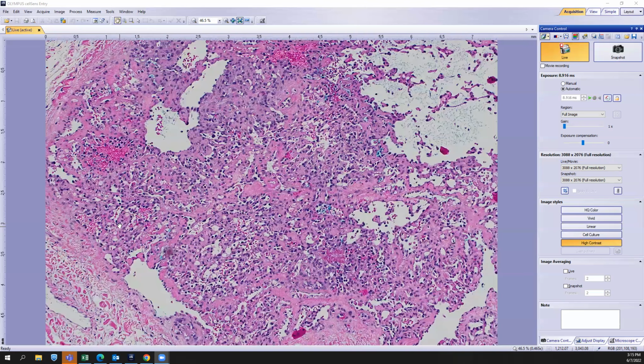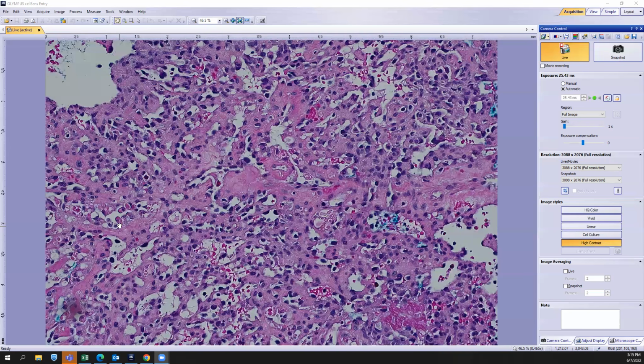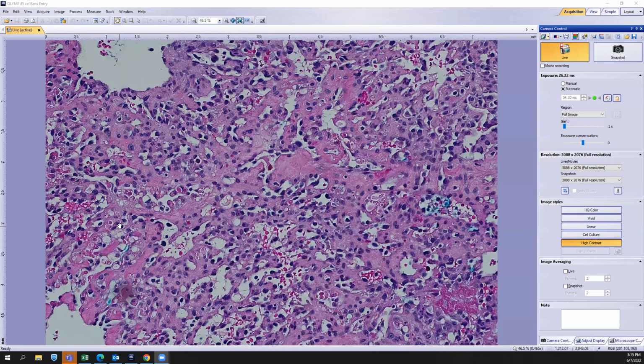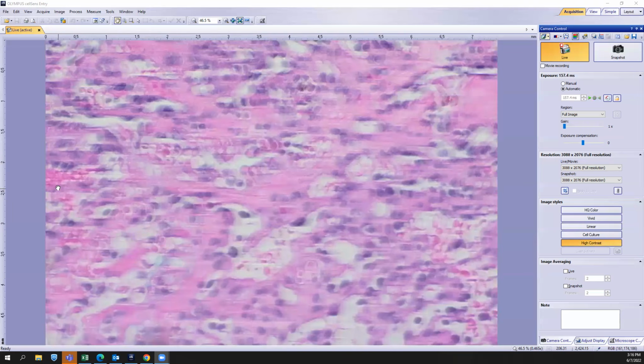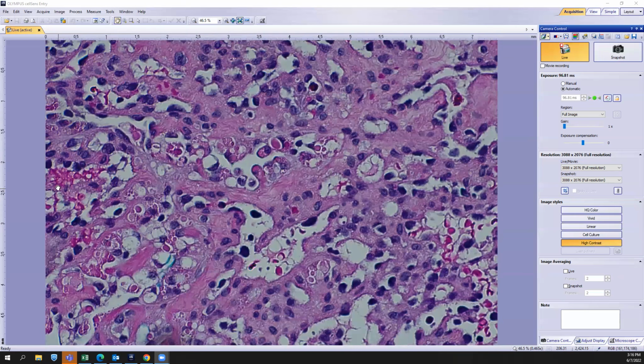Of course, we're always looking to make sure that these endothelial cells are not too atypical, and actually they look pretty homogeneous, pretty bland. Interestingly, though, this particular vascular neoplasm has a lot of these eosinophilic inclusions spread throughout the stroma and between, and getting a little bit close even to the lumen here. So you'll notice there's quite a bit of these eosinophilic inclusions. I hope you'll appreciate just a few examples of those here.